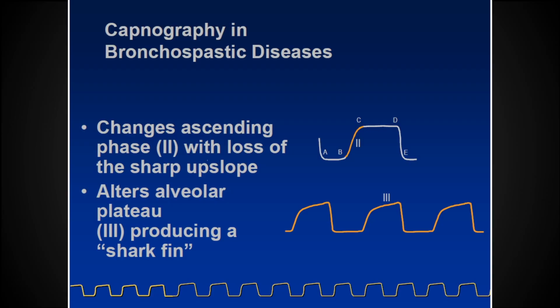Bronchitis. So here's what this is showing us. This is showing us that I have a physical restriction of the bronchioles. Whether that's because they're spasming or because the interior lumen is clogged up with mucus, in any case, this shark fin is implying that I'm having a restricted bronchiole, specifically.